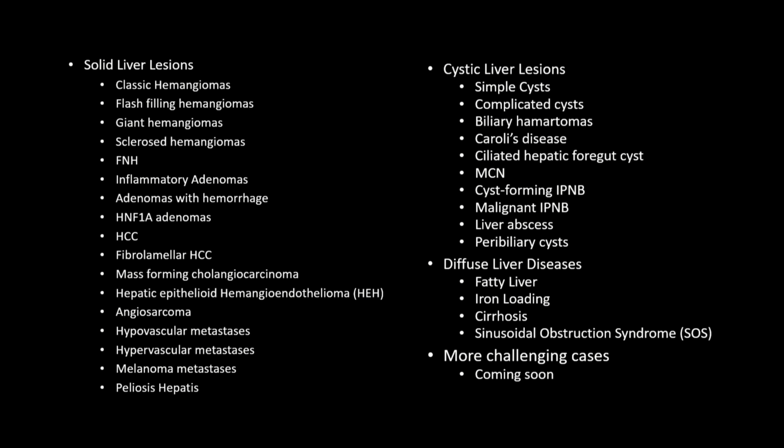And of course, in the liver MRI course, we're going to cover in detail the typical appearance of all of the liver lesions that you need to know. And so then if you know those characteristics, when you see a liver lesion on MRI in real life, you'll be able to note the 4 characteristics that we spoke about and then put the lesion into a box to know what that liver lesion is, or if there's a differential between a couple different types of liver lesions.